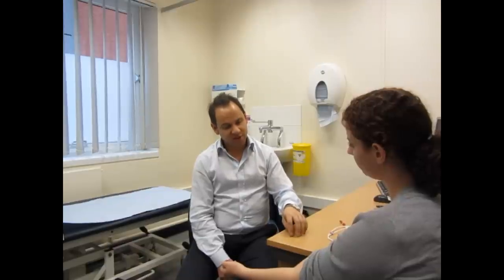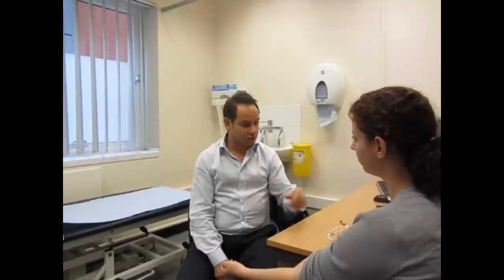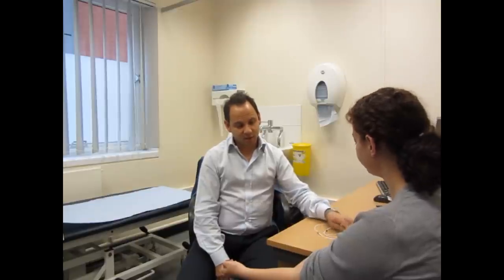The beauty of having a fistula at this stage is that it's ready and waiting for you when you need dialysis. So when your nephrologist, the renal doctor, says, right, you need to start dialysis, the fistula is ready and waiting for you. If you need dialysis before the fistula is mature, we can always use this central venous catheter as a temporary measure. Now, we've talked about central venous catheter, and we talked about having an arteriovenous fistula.